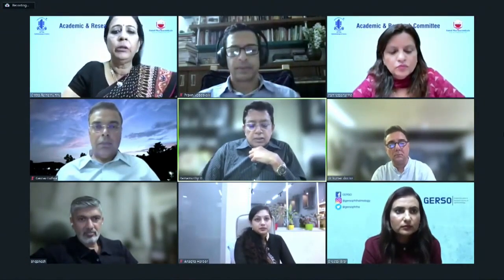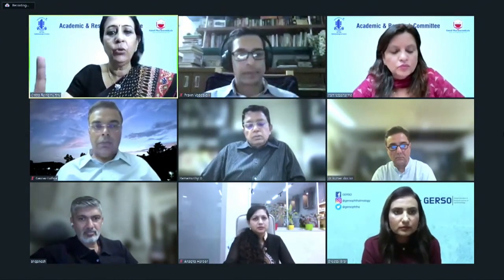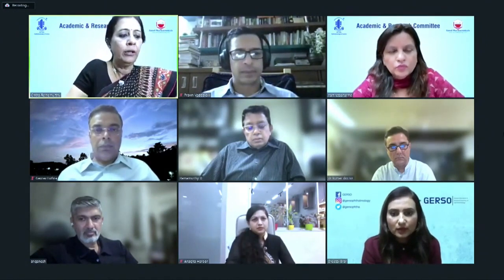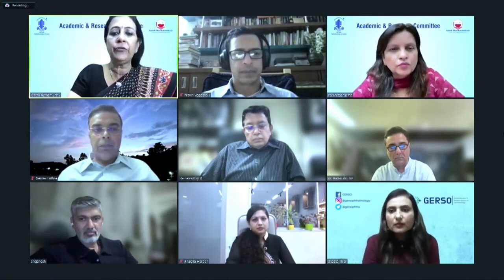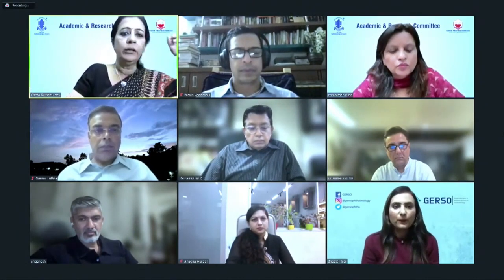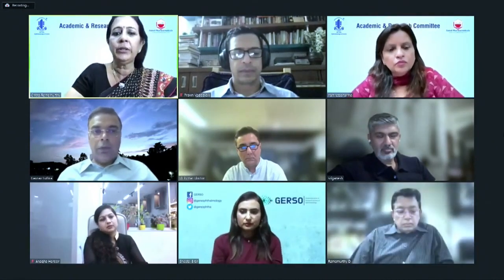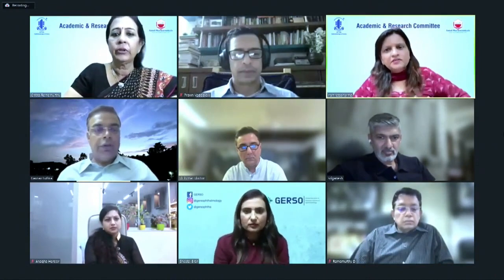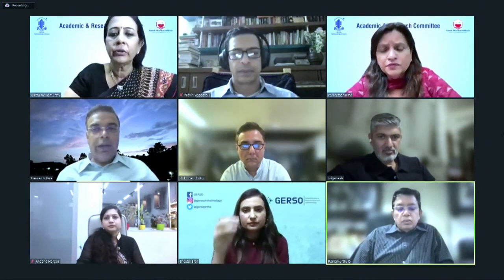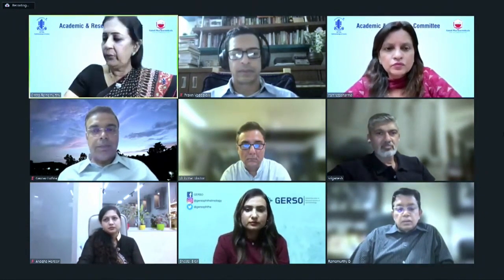Any comments on this? I think we are running short of time. Sorry, just one more question I have for the expert. Supposing you have a hyperopic shift after a CTK, as Dr. Ramurthy has discussed, has anybody done a treatment for that, or have they also regressed with time? You should not. They generally regress with time. I don't think you really need to do anything. Absolutely, in fact, you should not touch it. Okay, I think we are running late, though.